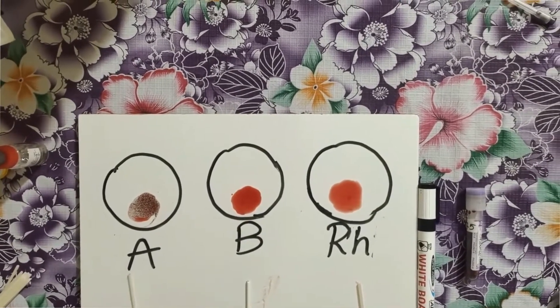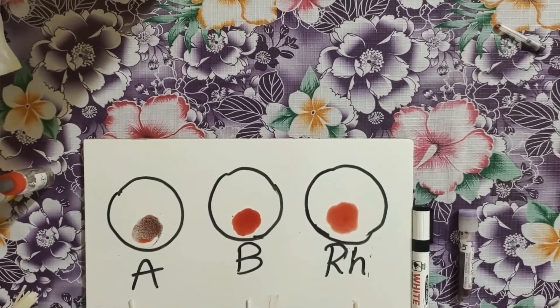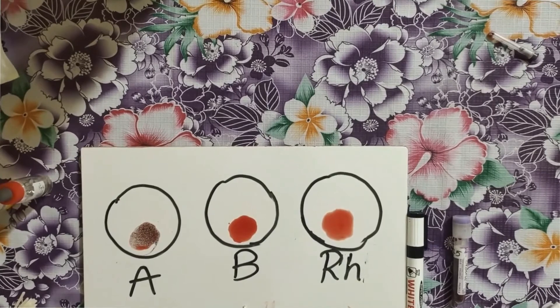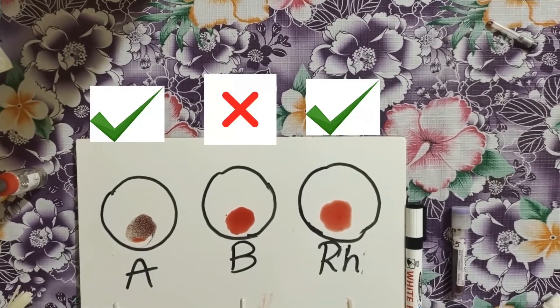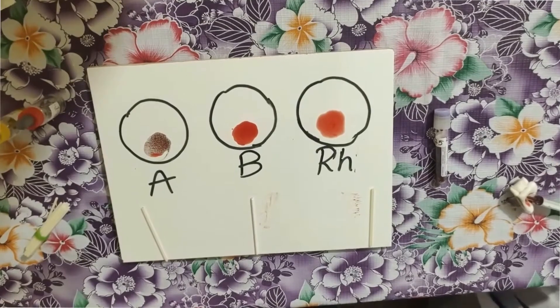We have to use only one stick for each circle for mixing, so that the blood doesn't mix with the other. Now, if agglutination happens in any of the circles, then that is the blood group of that person. The agglutination has happened in A and RH. What is the group? This blood group is A positive.